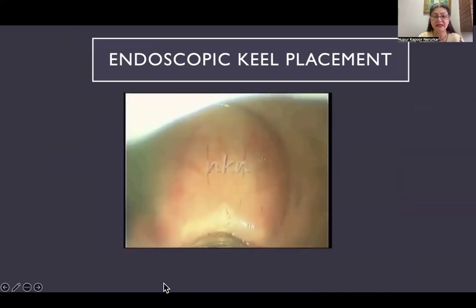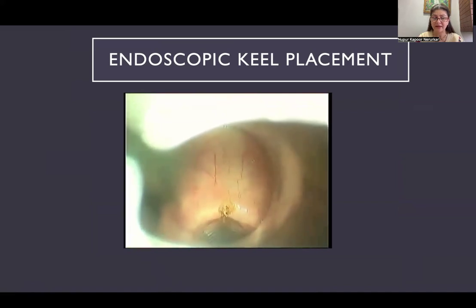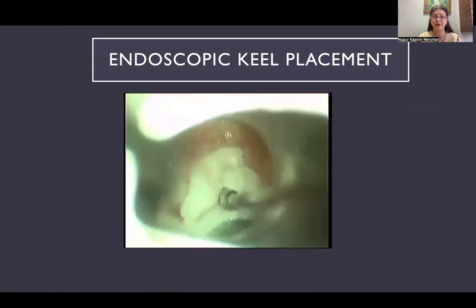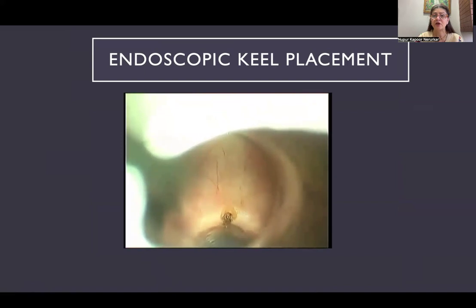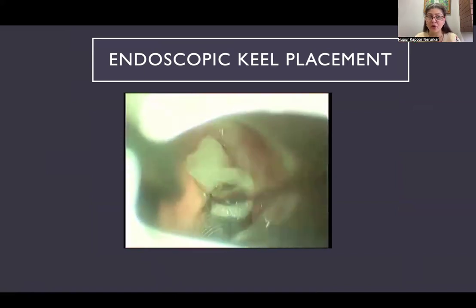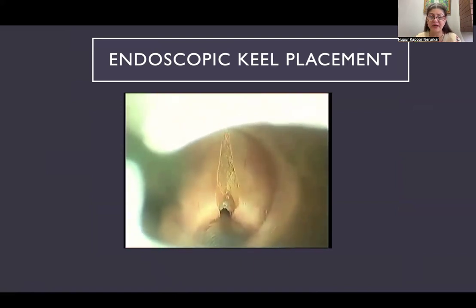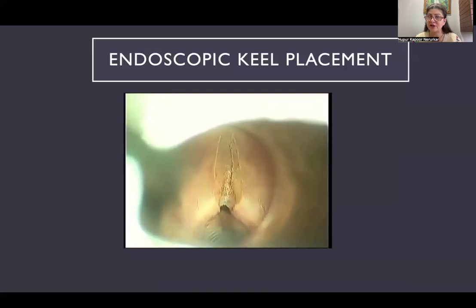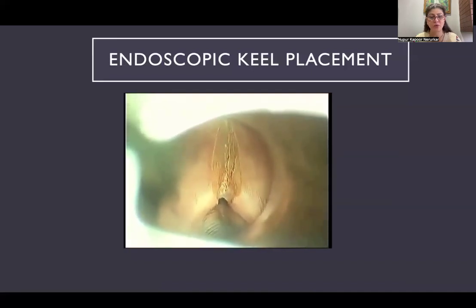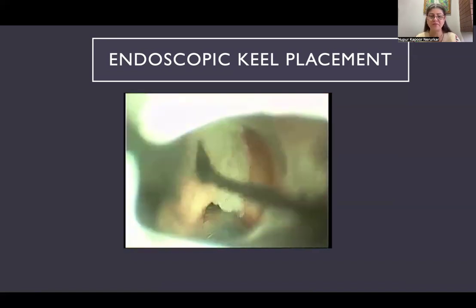This, as you can see, is a very thick web, so laser-safe tube in situ, and we are doing the cut again midline. This is not a cut on one side, because the idea is that though there is going to be no epithelial cover and there's going to be a bilateral raw area which is thick, we are going to have a keel in place for 3 to 4 weeks while the epithelialization is taking place, and then one goes in again under GA, short GA, and removes the keel once the epithelium has healed over.